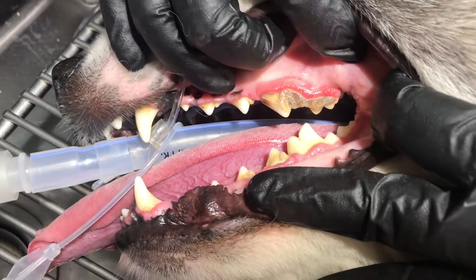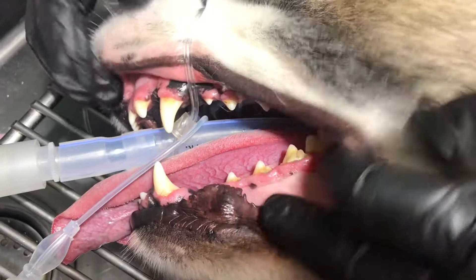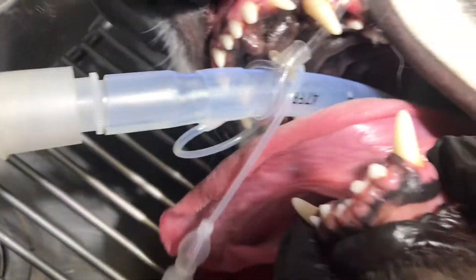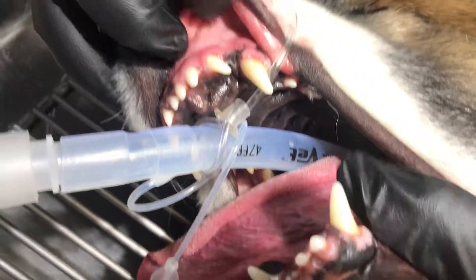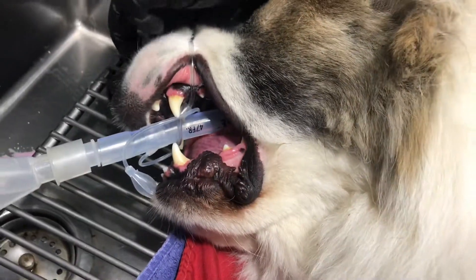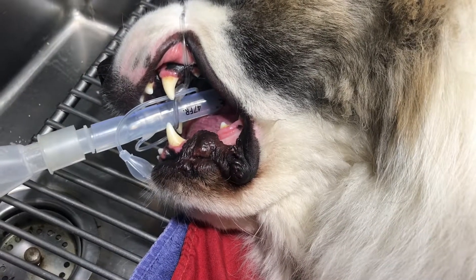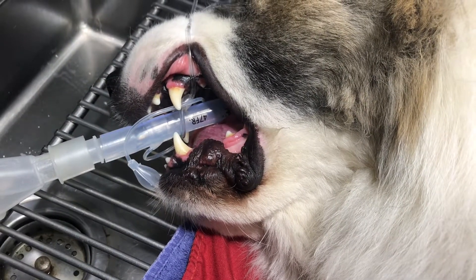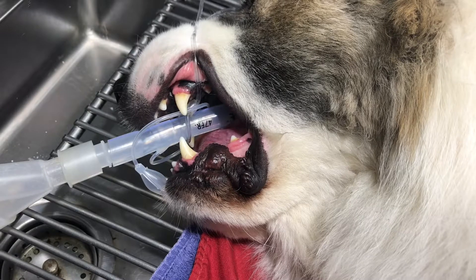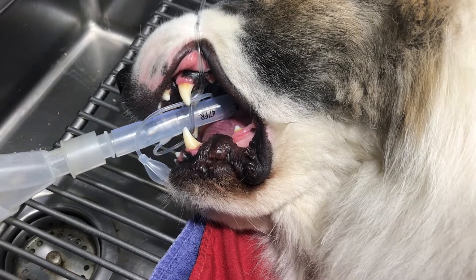Let's try to get a good examination and see what we're going to deal with throughout the dental cleaning. He's got a pretty good amount of tartar on his back teeth. We really don't see much on the front teeth, just a little bit on the canine teeth — the big fang teeth in the front. But the back is the most common area where dogs get tartar, and a lot of owners don't know that. They think their dog's teeth are clean, but when we get in here, we see the nasty stuff.